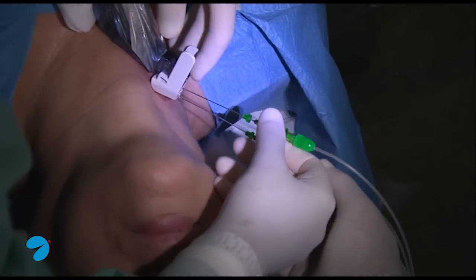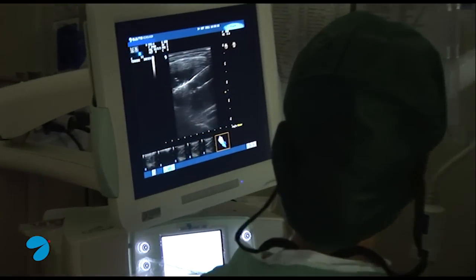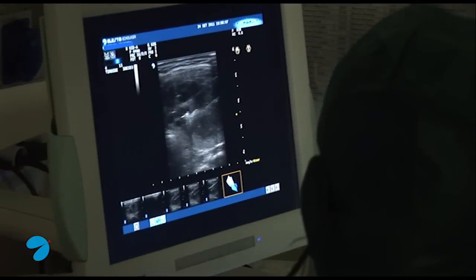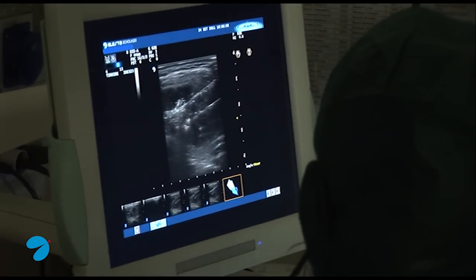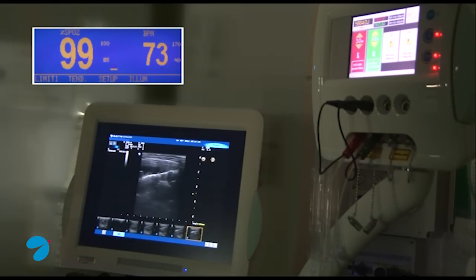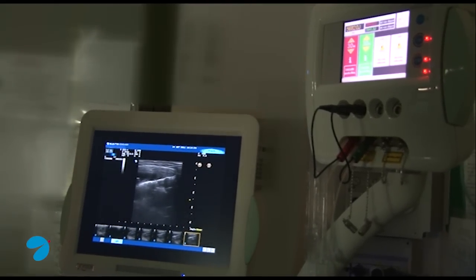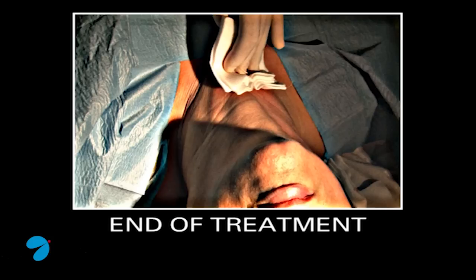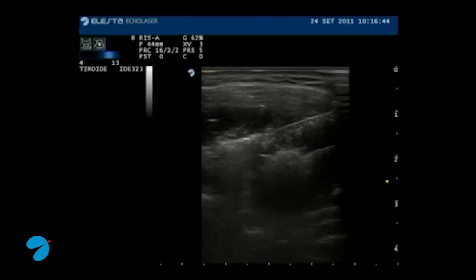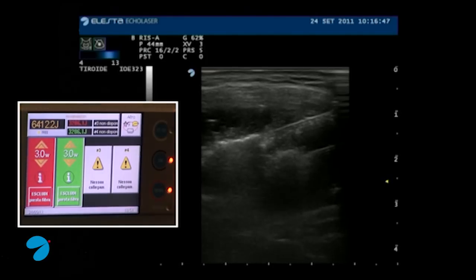In this case, after the treatment of a nodule tissue portion, we proceed to reposition needles and fibres, performing a second treatment in order to increase the volume of treated tissue inside the nodule. At the end of treatment, we verify the delivered energy per fibre.